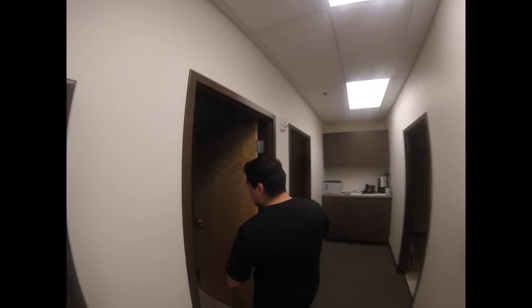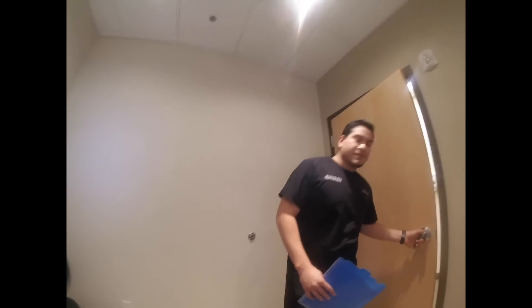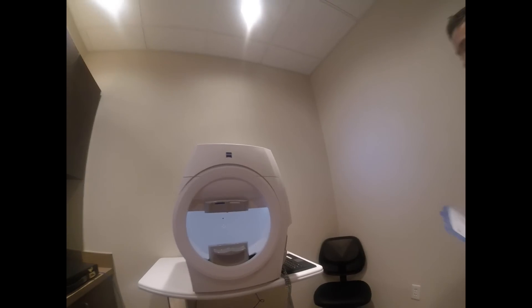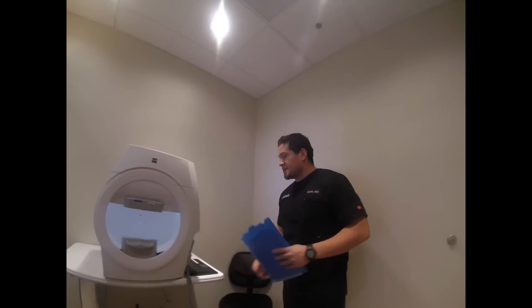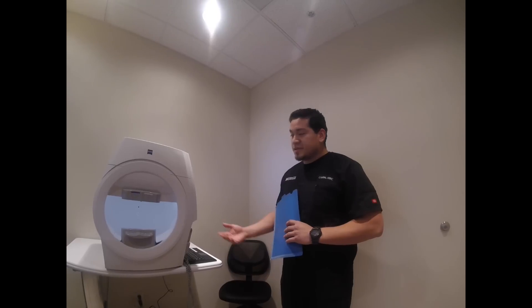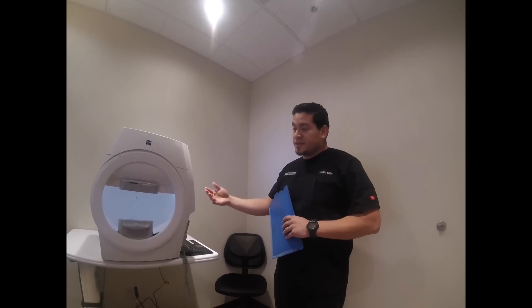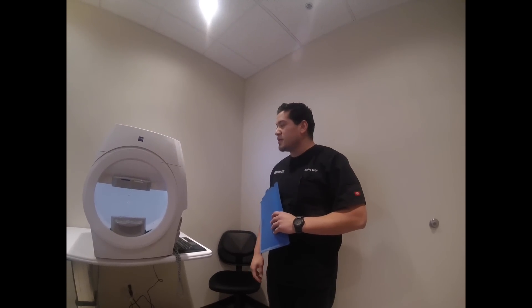Alright, we're going to start off in here. If you can have a seat right there for me. Alright, first thing we're going to do is take this visual field test. We take it for glaucoma, we take it for a lot of other stuff, but mostly for glaucoma.